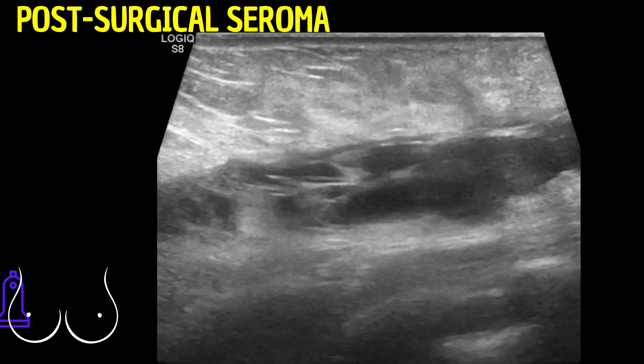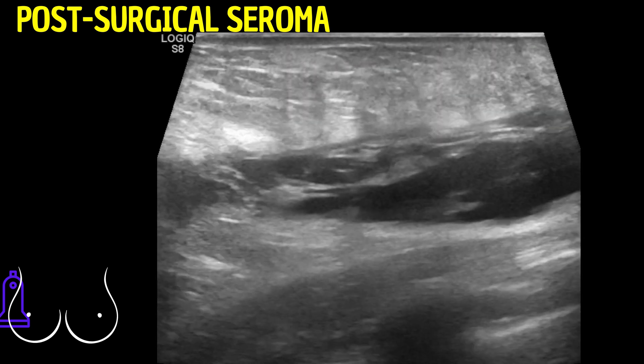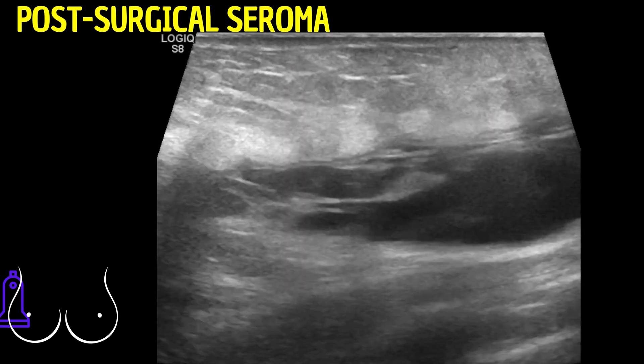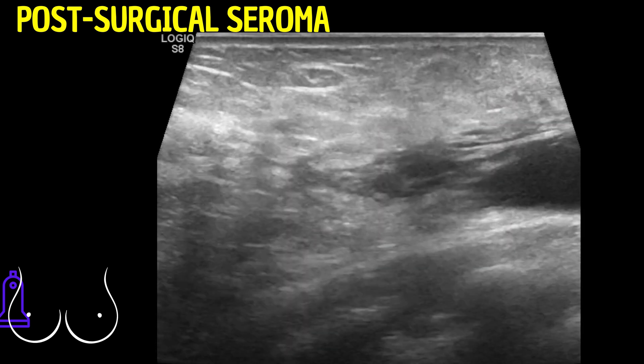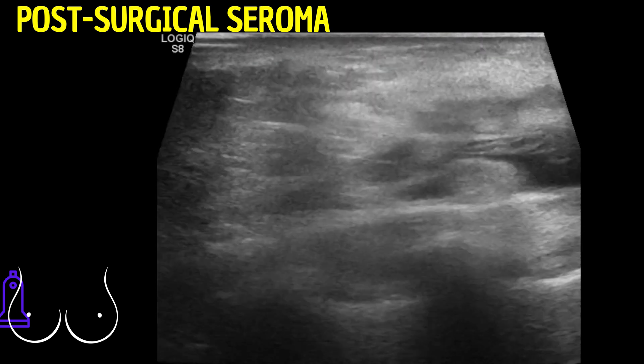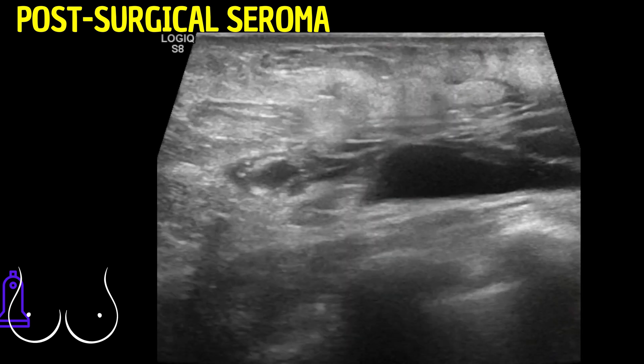In this ultrasound video, we observe a seroma, a complication following a mastectomy with implant placement.